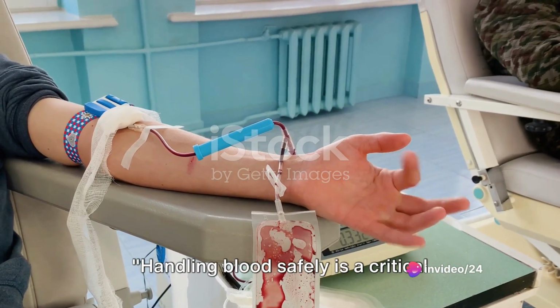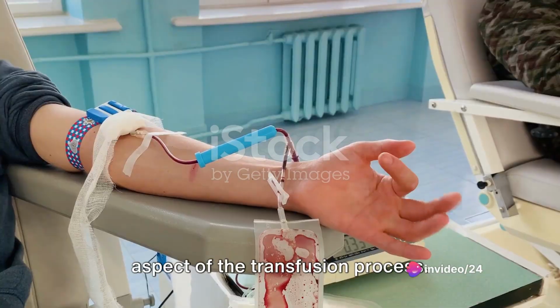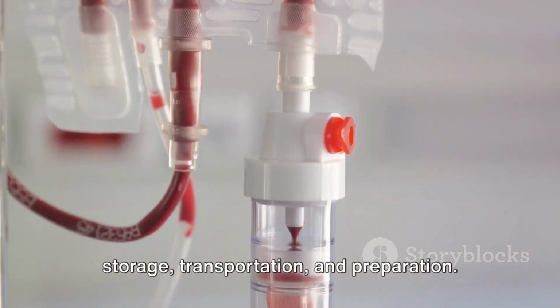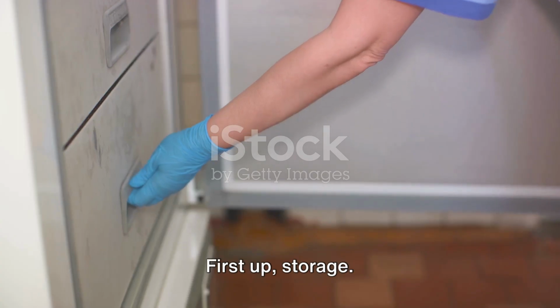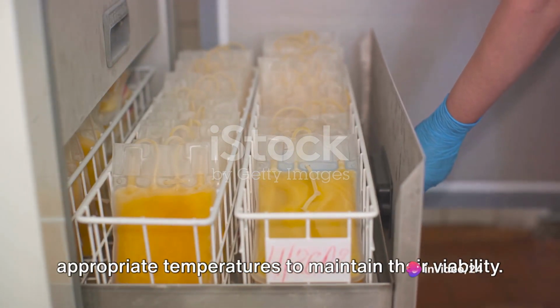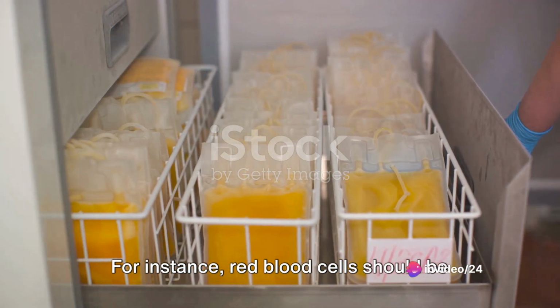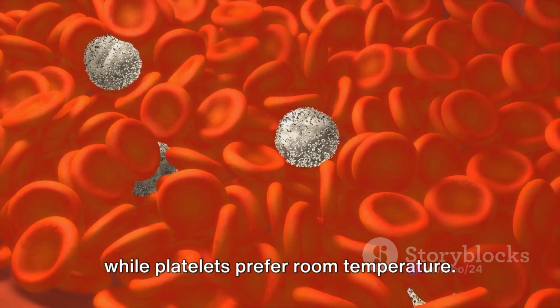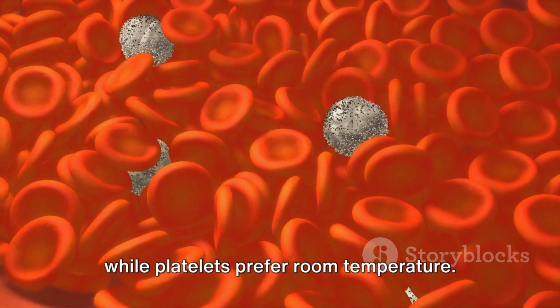Handling blood safely is a critical aspect of the transfusion process. Let's break it down into 3 key areas: storage, transportation, and preparation. First up, storage. Blood products must be stored at appropriate temperatures to maintain their viability. For instance, red blood cells should be kept between 1 and 6 degrees Celsius, while platelets prefer room temperature.